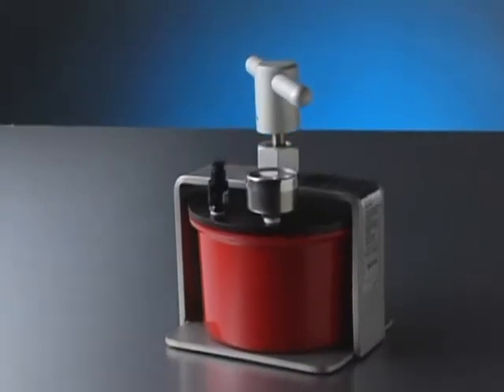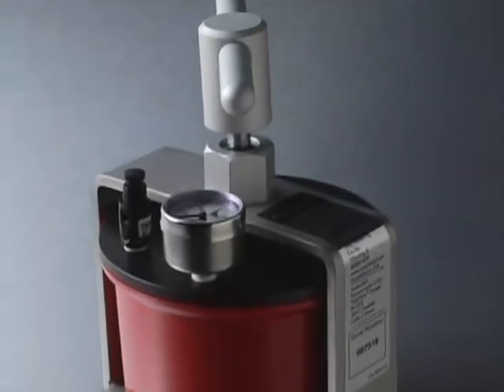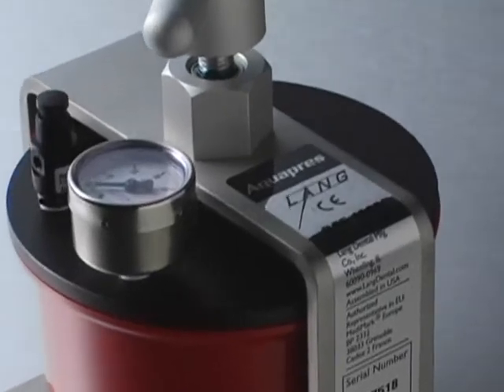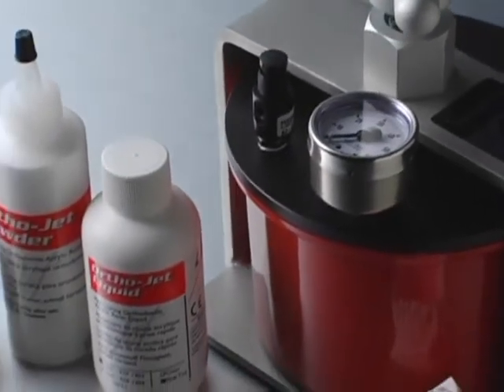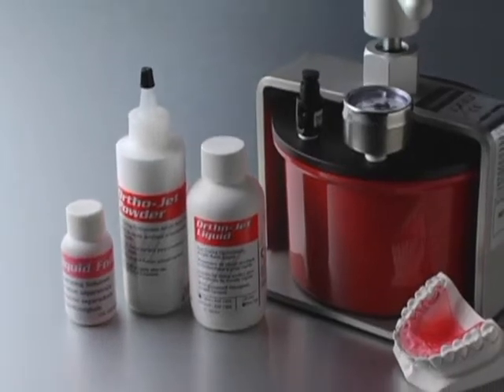The AquaPress is a compact pressure curing unit designed for use with self-curing acrylic resins. The AquaPress is used when repairing, relining or rebasing a denture, or when fabricating an orthodontic appliance, bite plane appliance, or a temporary crown or bridge.